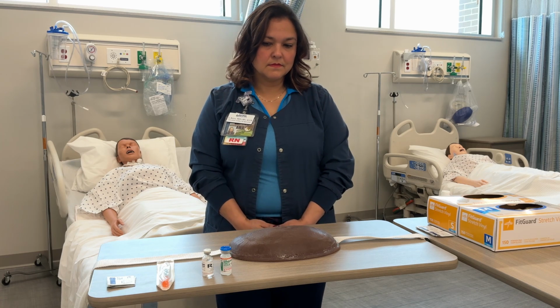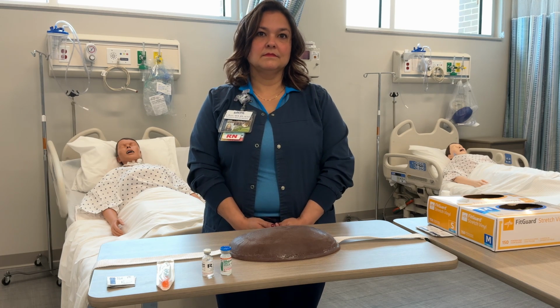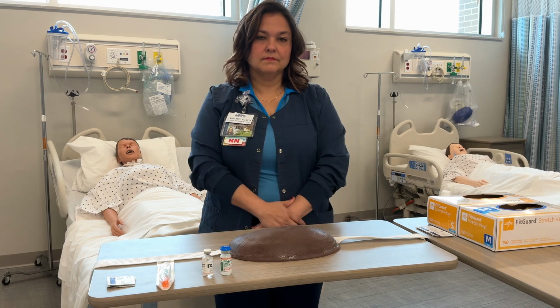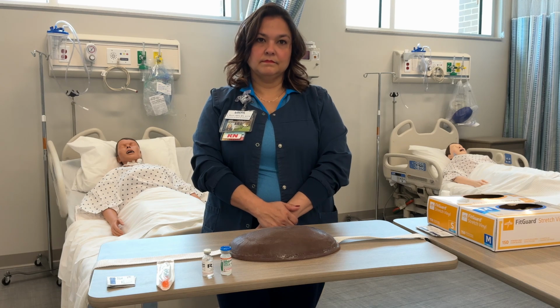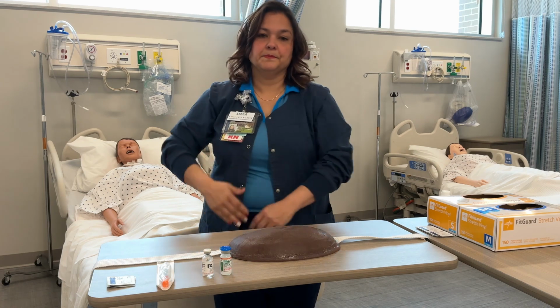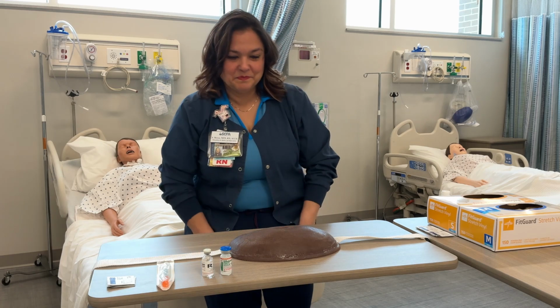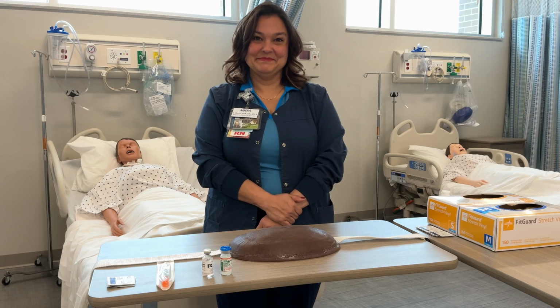Some of the most common injection sites that you're going to see insulin given in is going to be in the abdomen. And we have a little belly right in front of us. So it's very, very center in the abdomen, kind of below the umbilicus area, is one of the most common sites. You can also give it in the outer part of the arm, right there on either side. You can also give it into the thigh, in that whole area of the thigh.